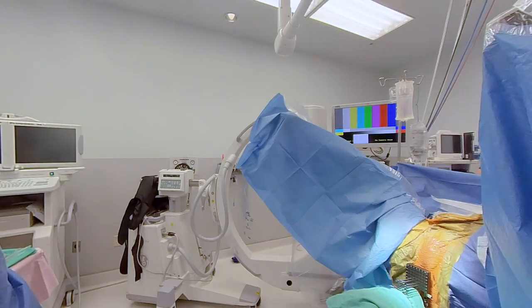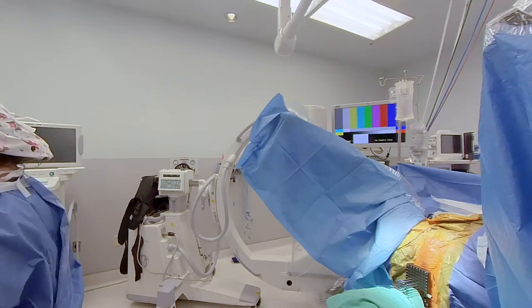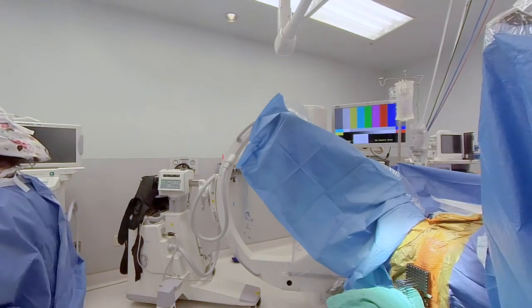So coming to the top of the gland, looking at the symmetry, we try to keep the dose cool around the bladder neck.